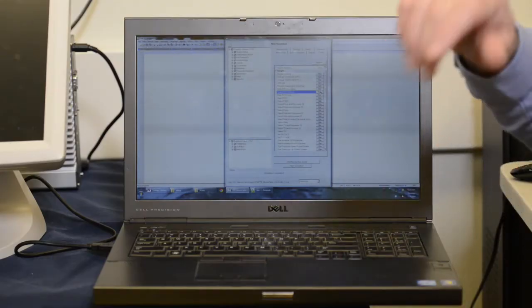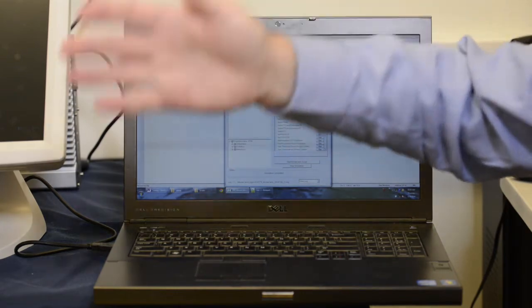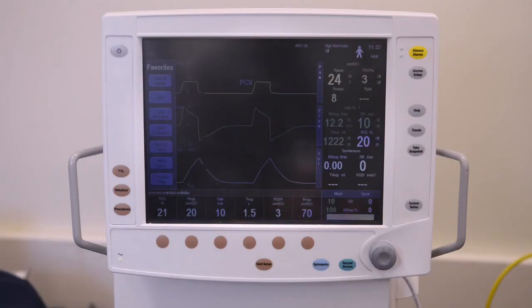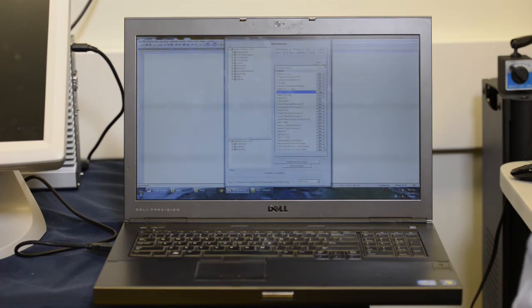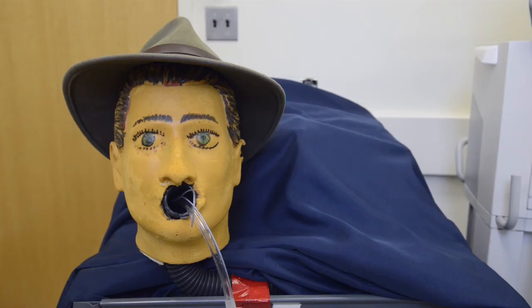Today we're demonstrating remote control of a patient ventilator. The scenario that we're walking through here is that the patient is in a patient isolation room. They have potentially a case of Ebola, and the respiratory therapist wants to change the ventilator settings being delivered to that patient, but they don't want to have to enter the room and be potentially contaminated. So with this device demonstration, the therapist can monitor the patient using the patient monitor outside of the room and control the ventilator settings outside the room as well, with this device that's remotely connected to the ventilator inside the patient room.